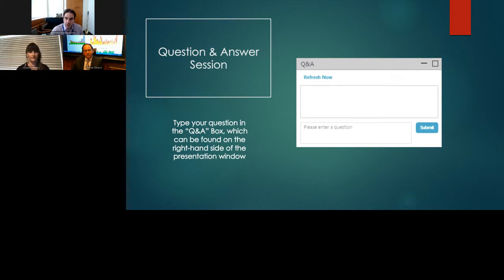Wonderful. So the next question is about taking radiographs through the glass and whether having leaded glass windows affects that. And we've actually seen no effect on image quality with any of these windows. We have even employed this through windows with metal Venetian blinds, where if you open the blinds, the density of the metal that you're imaging is thicker, so you see linear lines on it.